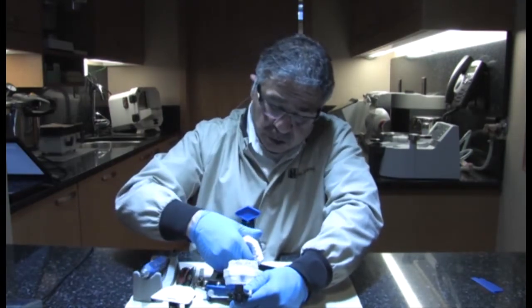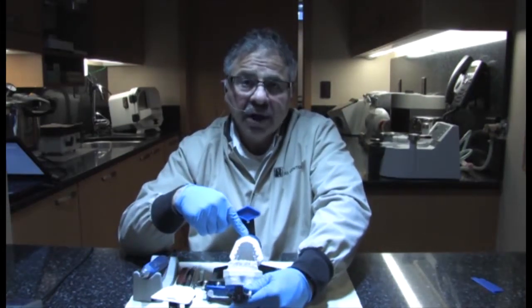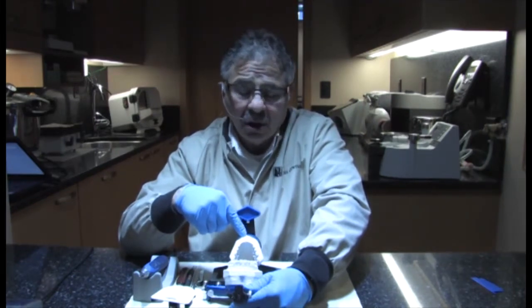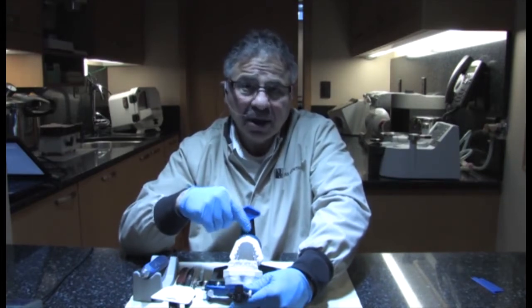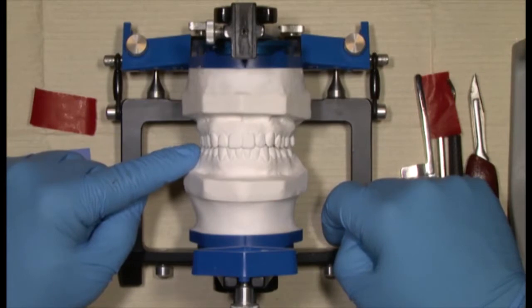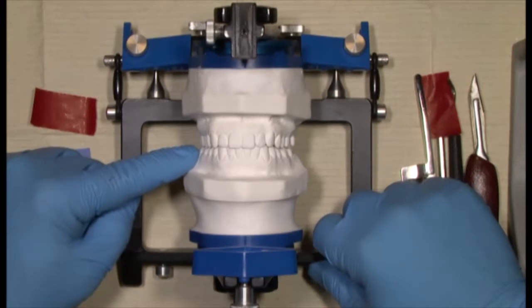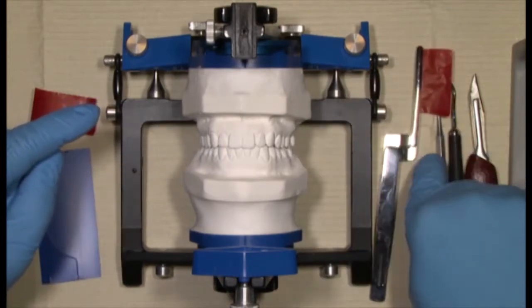The lower arch was then mounted using the bite records that were gained utilizing the deprogrammer. The deprogrammer hopefully validated the initial point of contact on the models or on the mounting that we're able to achieve in the mouth based on what the patient said. As you recall, Cochine pointed to the molars on the right side, actually fairly posterior, and in essence, it was the second molar.